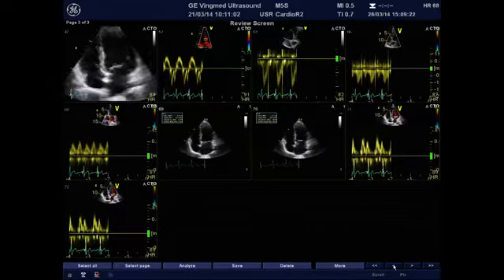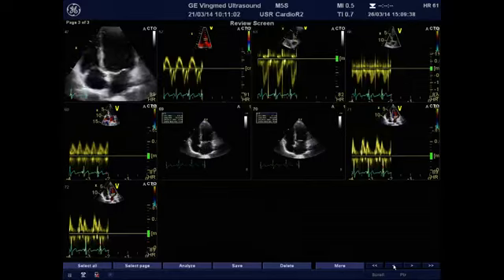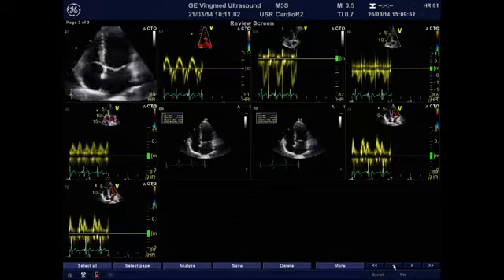And this was the big advancement brought by tissue Doppler, and among its applications, maybe this is the most important one, because there is this parameter combining two measurements from two different views, but which are easy to acquire, and the result may orient the clinician as to the level of filling pressure, which is a very important pathophysiological parameter because it relates not only to symptoms, but it also relates to outcome, to prognosis.